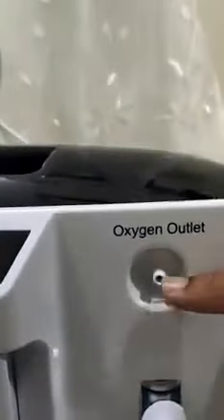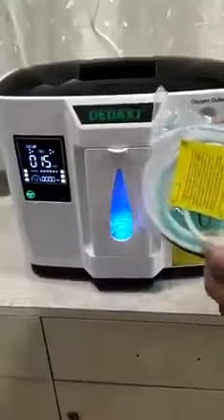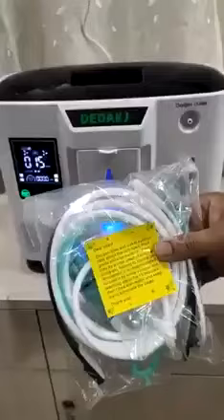From here is where the oxygen will come out. We need to use this tube — insert this tube here and use this. It's a very simple machine to use, and that's it.